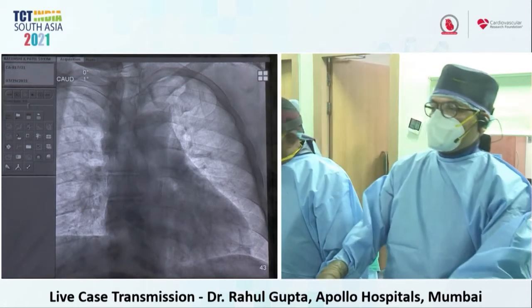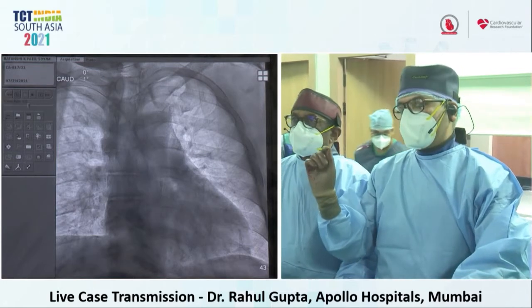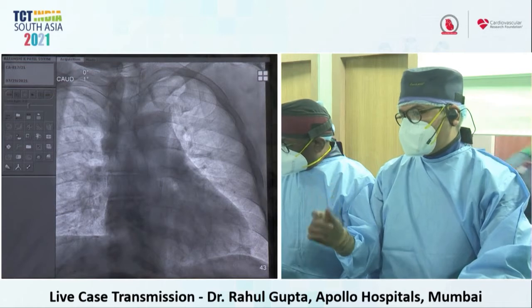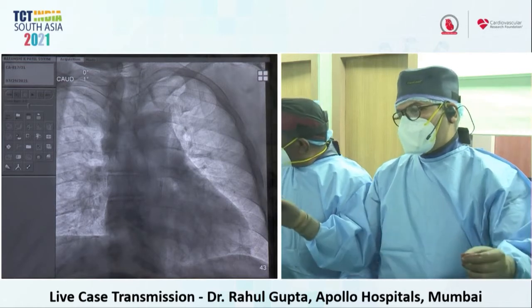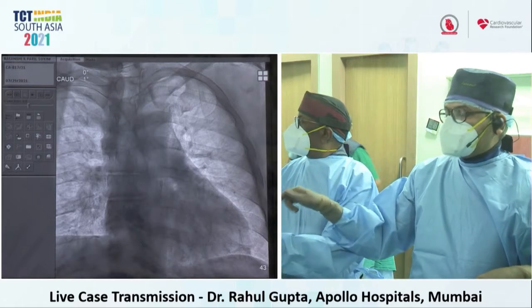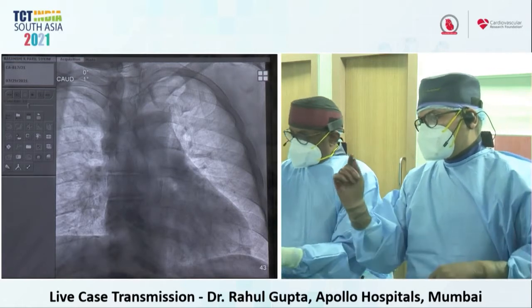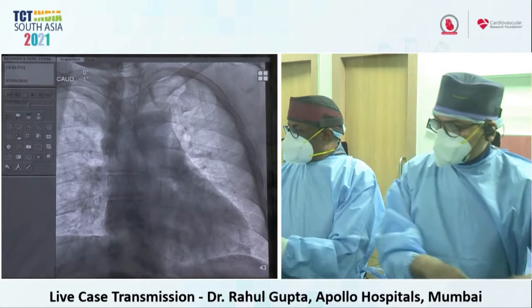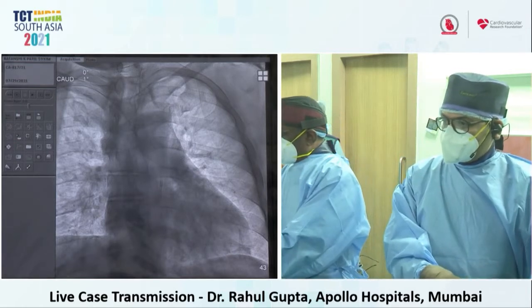When we are doing the direct puncture, I'll just describe the direct puncture technique as well. We go directly, as we are taking the radial sheath. There is a wire which is available, the 021 wire, over which we then feed the dilator the same way it has been fed, and then there is the rapid exchange port, and we go into the radial artery.